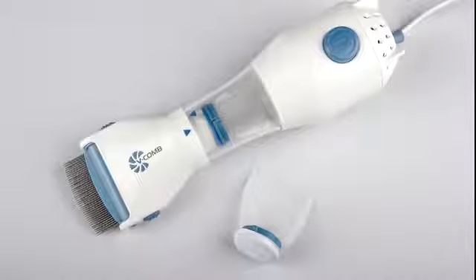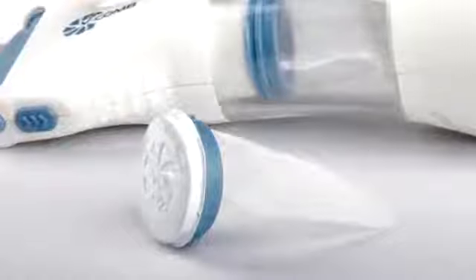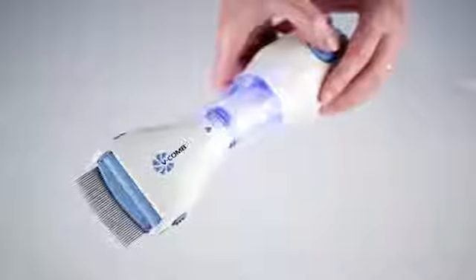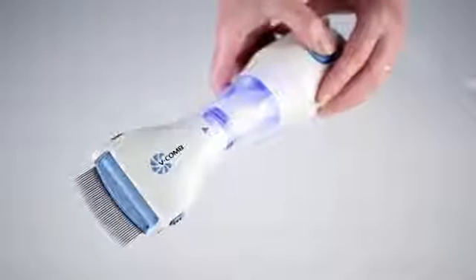The V-Comb extracts head lice and eggs from the hair into a disposable capture filter housed within the unit. The filter unit is illuminated by a bright LED light, so you can see what has been removed from the hair.